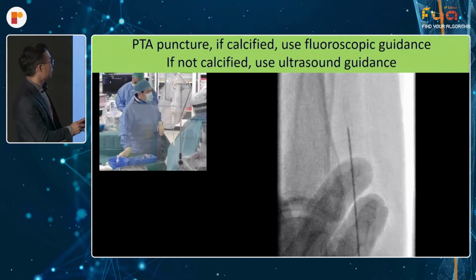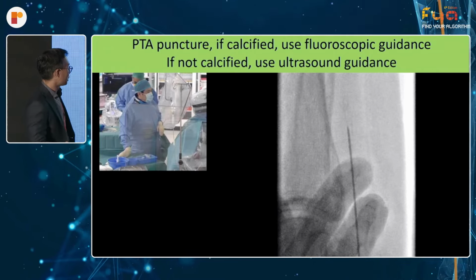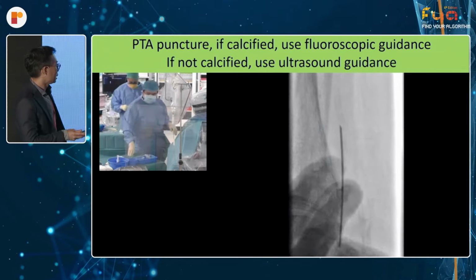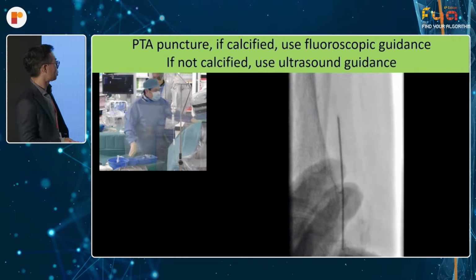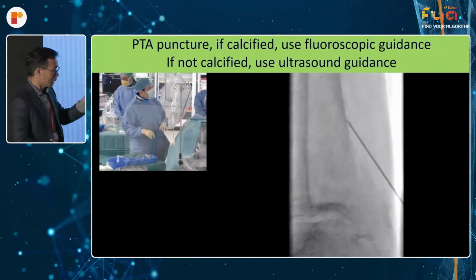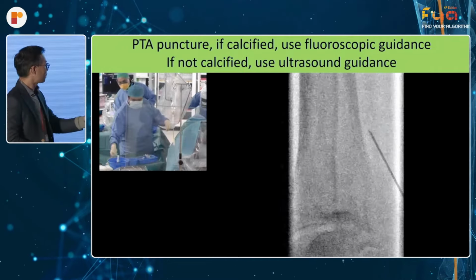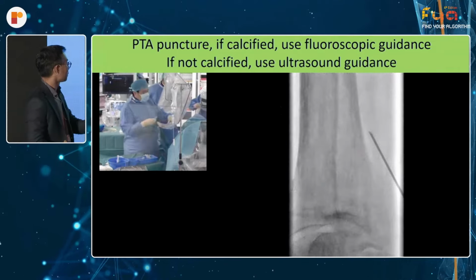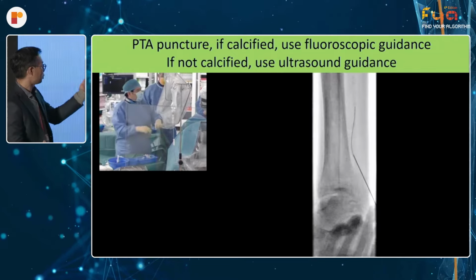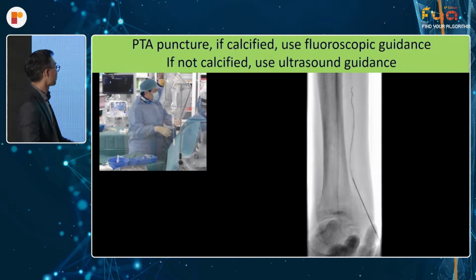For PTA puncture, for me, if it's calcified, I will use fluoroscopic guidance, and it lends itself to a very nice visualization, in real time, and you have less to control. So first of all, I place it in the lateral position. I puncture along the line of the vessel, going deep, and at some point you will pass it. Once you've passed it, you feel it because it's so calcified. Then you change the projection to 90 degrees, and you can see if you're inside, then you push your wire through. If you're not inside, you just pull the needle back until you're inside the artery.